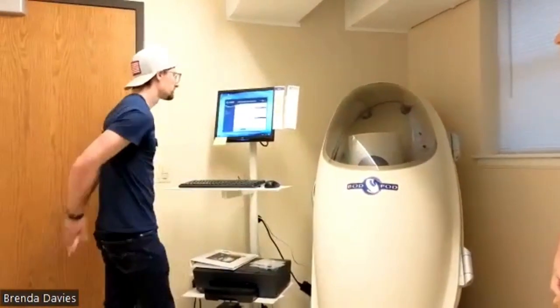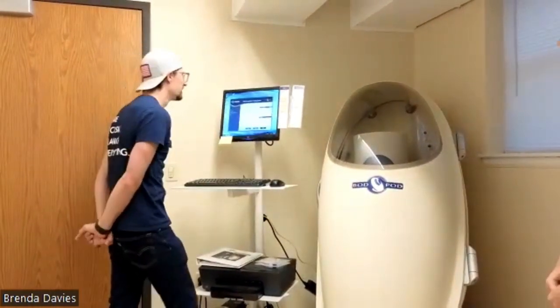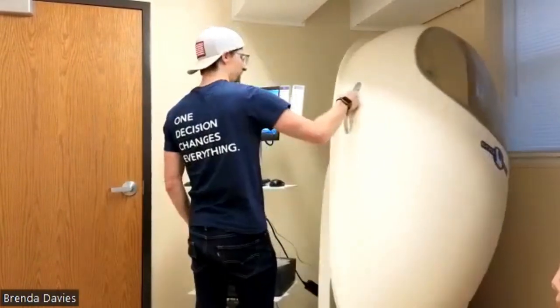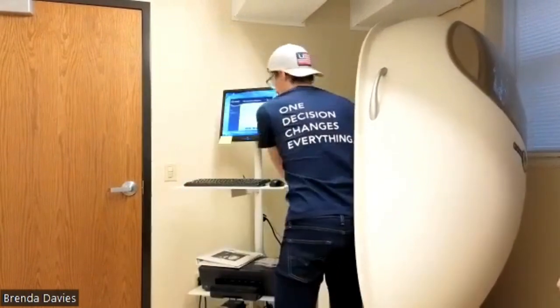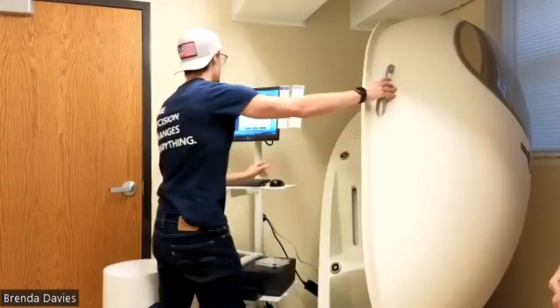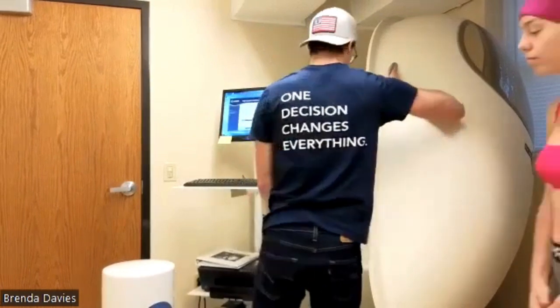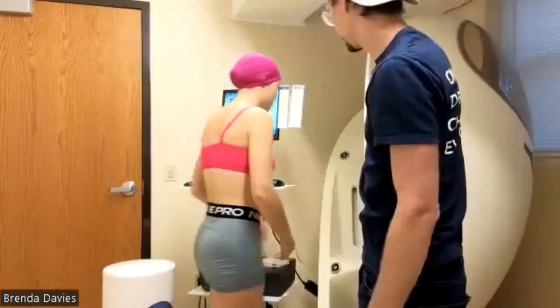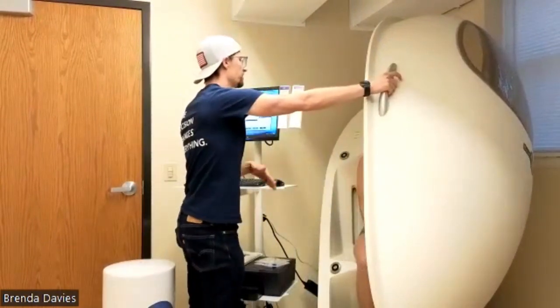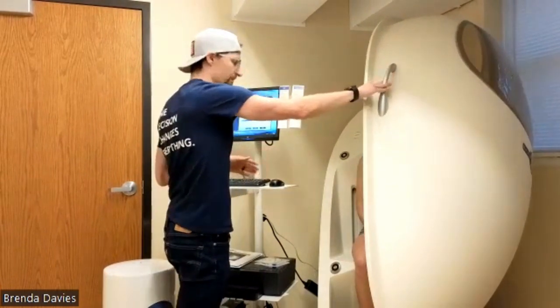All right, so we can then compare the weights that we have manual to the weight that is assessed here. We are going to open up the door and remove the calibration cylinder. Okay. And then we'll ask the subject into the Bod Pod door, so into the Bod Pod chamber. Okay, so when you're in here, just breathe as normal as possible. Try to relax. Try not to move around.